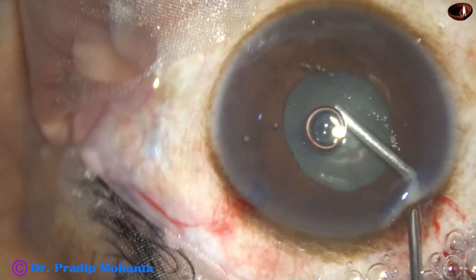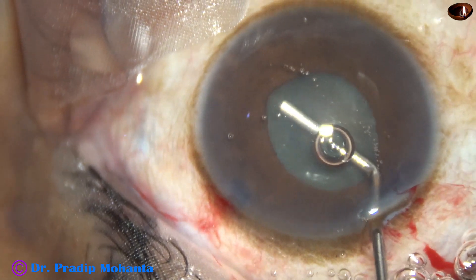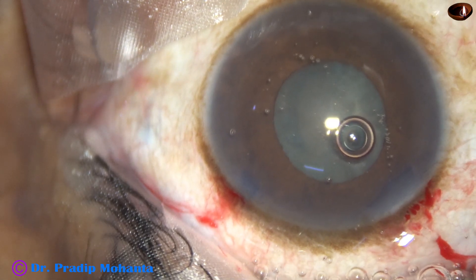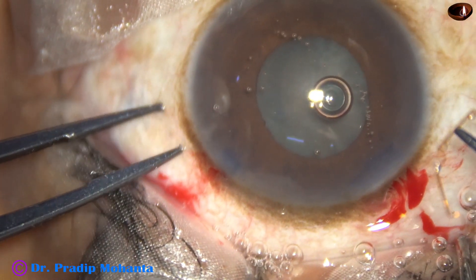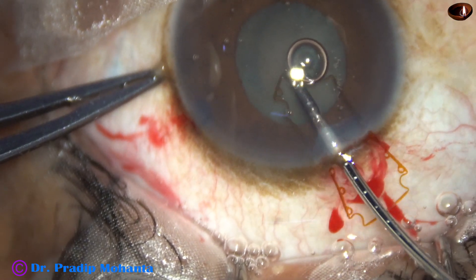The viscoelastic is injected under the iris to make some room for a pupil expansion device, which in this case is a B-hex ring. And here it goes — the leading flange is placed.